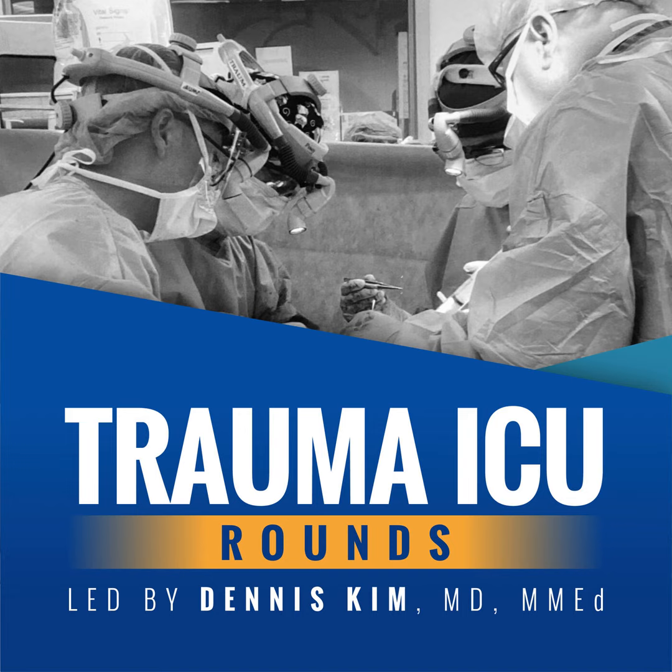It employs a closed loop method of ventilating patients and provides pressure ventilation with a volume target. Essentially, the ventilator monitors the progress of tidal volume delivery and adjusts its pressure response based on one of two methods, either based on a single breath, and this is what's known as pressure augmentation, which we don't do a lot of, or over a period of several breaths, i.e. breath by breath, such as PRVC, which is also known as a dual control mode. So essentially for PRVC, this delivers patient or machine/time triggered pressure targeted time cycled breaths.